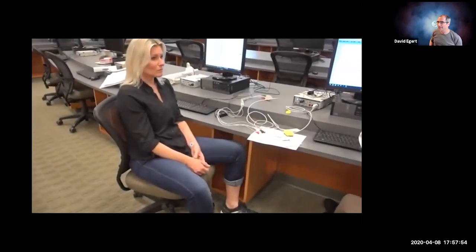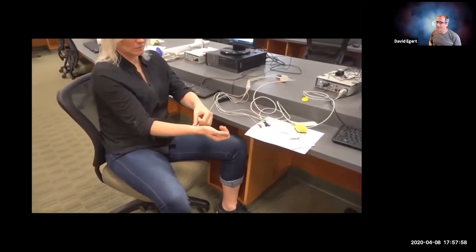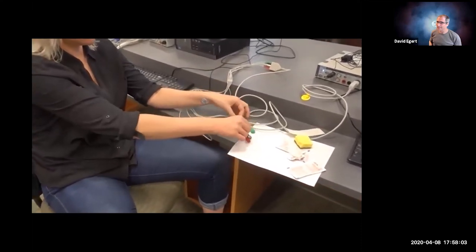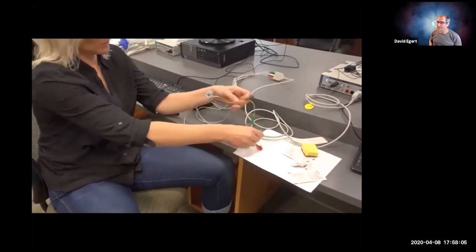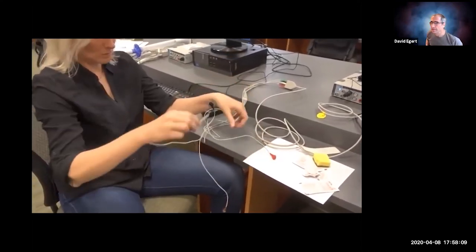Okay, so the white goes on your right arm. Left is black. Green on your right.